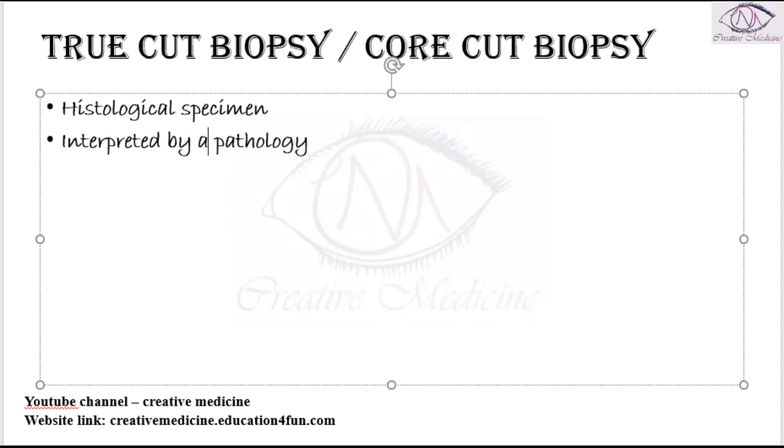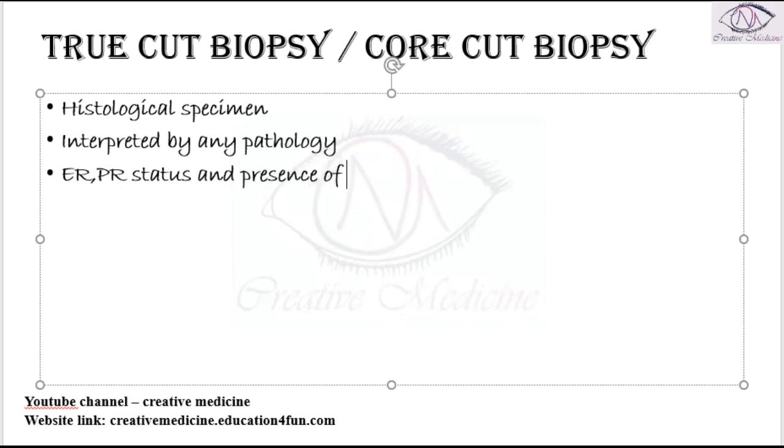In fact, any pathologist can interpret a biopsy specimen, and this true cut biopsy can tell us about the ER status, the ER-PR status, and also the presence of HER2 neu overexpression. This can be routinely determined.